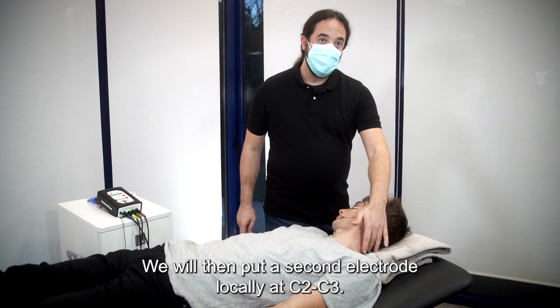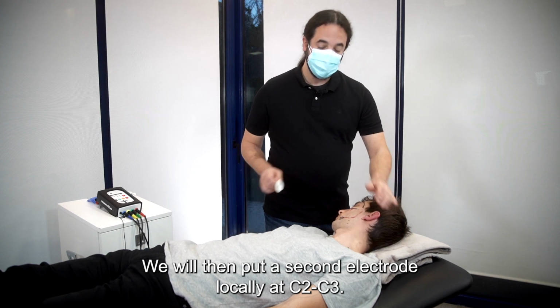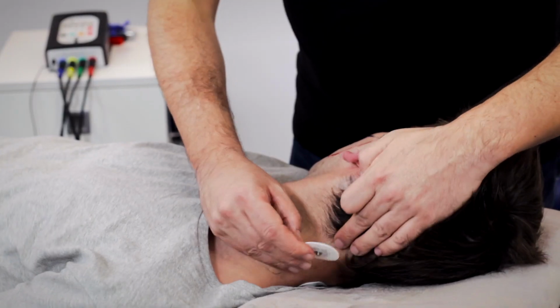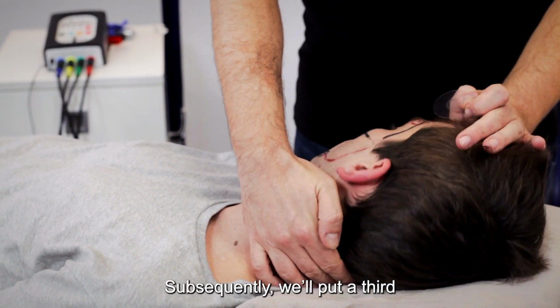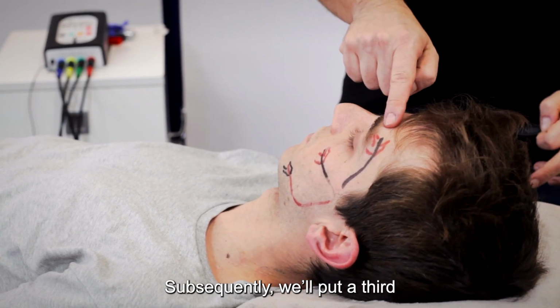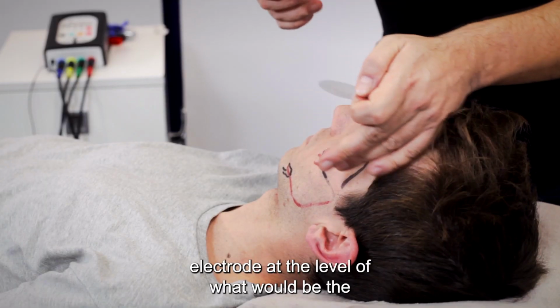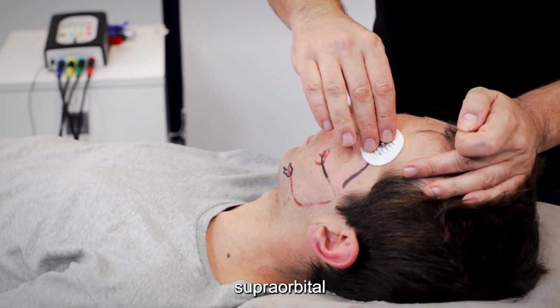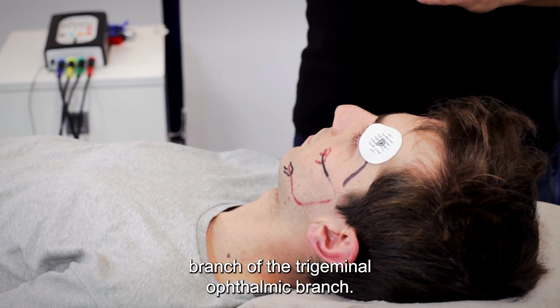We'll then put a second electrode locally at C2, C3. Subsequently, we'll put a third electrode at the level of what would be the supraorbital branch of the trigeminal ophthalmic branch.